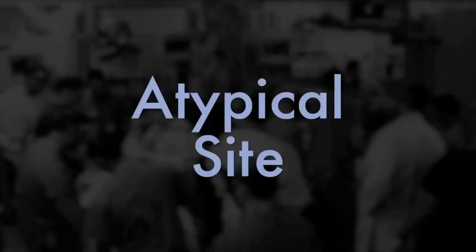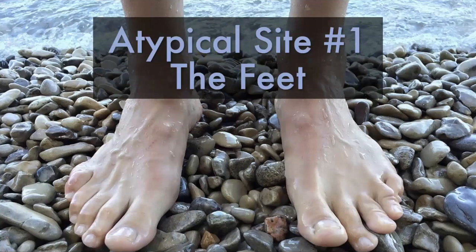So one of my favorite atypical places to look for an IV is, you guessed it, or probably not, the feet. I love looking for the feet. Go ahead and peel off those 4-day-old hospital socks and see if there are any big juicy ones floating on the dorsum of the feet down there. You'd be shocked at how many regular IVs you can just cannulate down there if people haven't already looked.